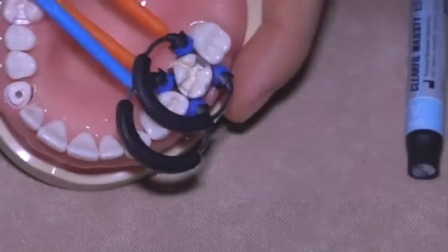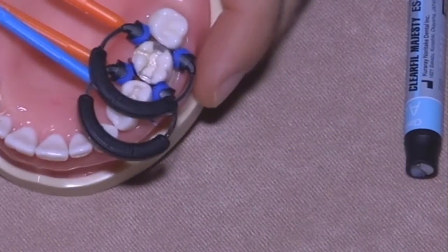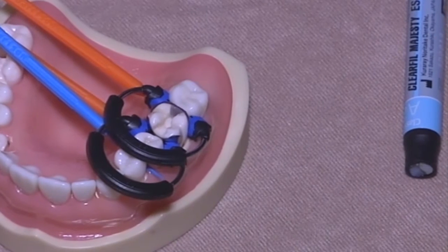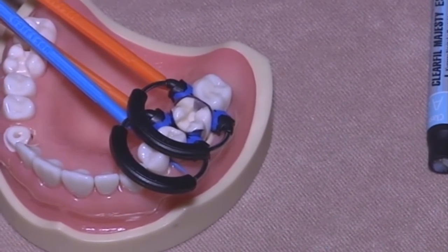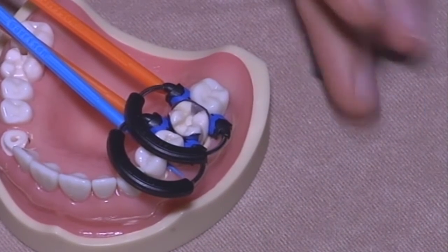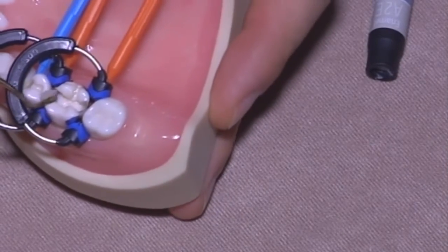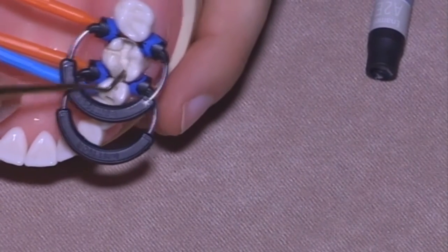Once you have this, light curing, just to fix it. In reality, don't save time with light curing. I think I told you 10 times today. And then again, enamel shades on the mesial wall.